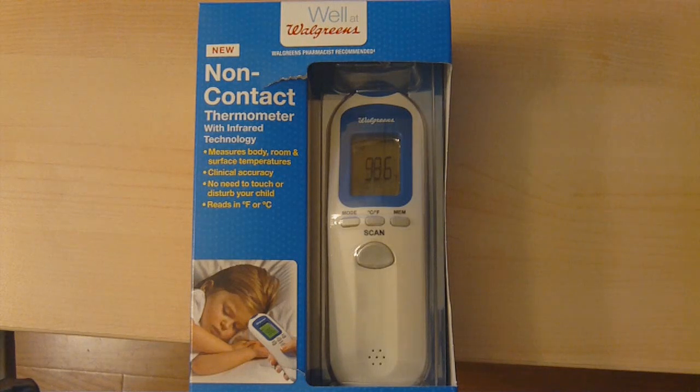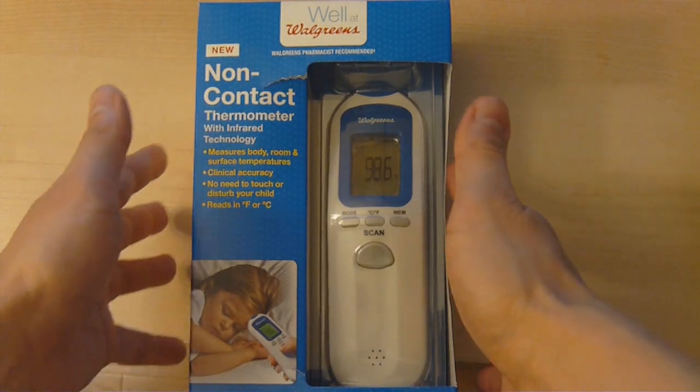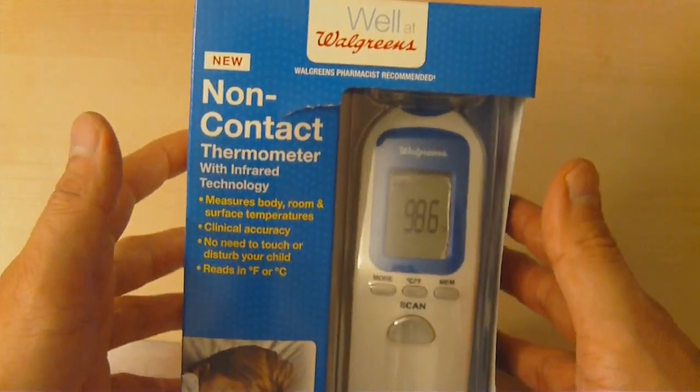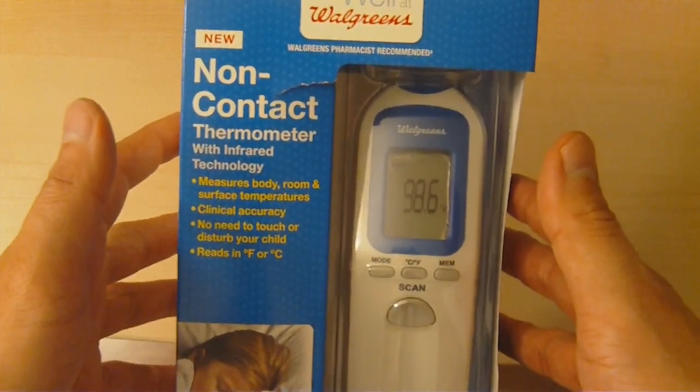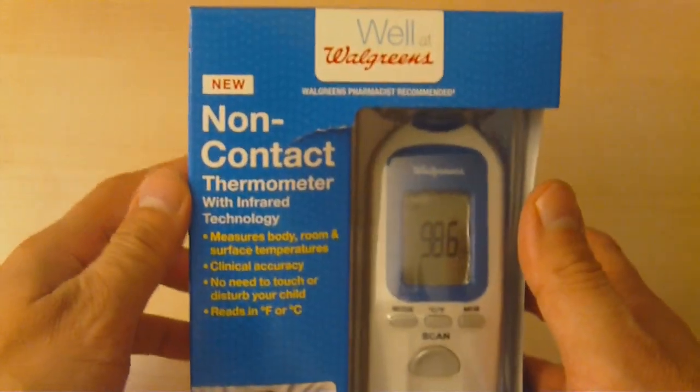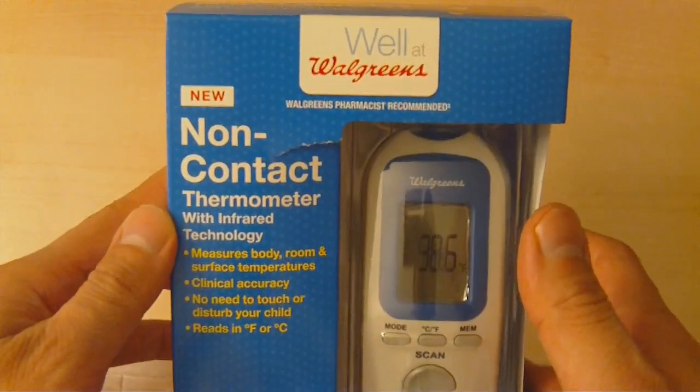As you know, thermometers have evolved over time. We started with simple mercury-based thermometers you stick in your mouth. There was the risk of mercury, so over time they developed digital thermometers you stick in your mouth, and then later thermometers you stick in your ear, and then temporal thermometers you swipe around the forehead. Now we have non-contact thermometers using infrared technology.